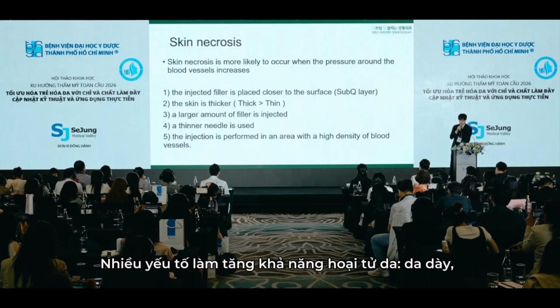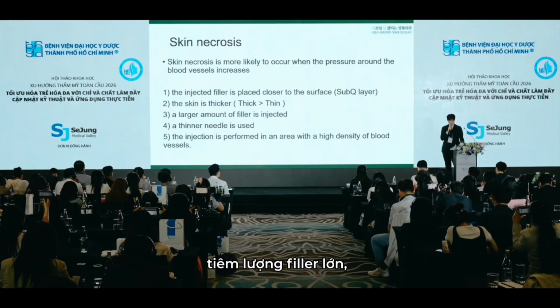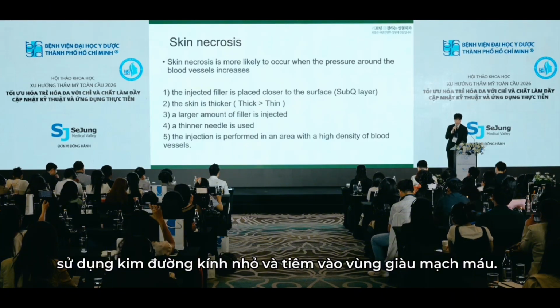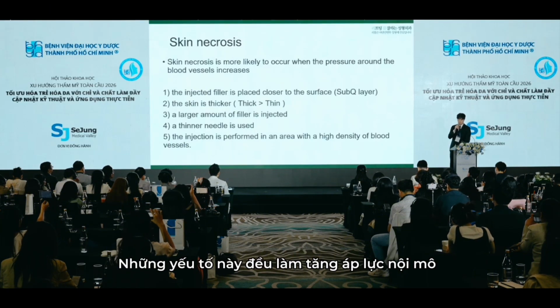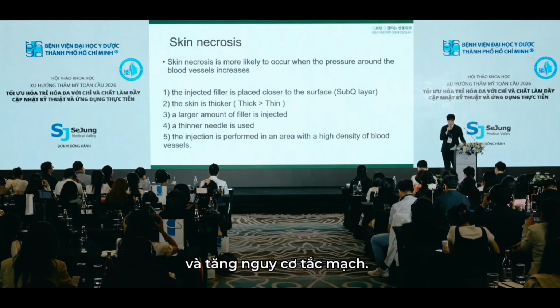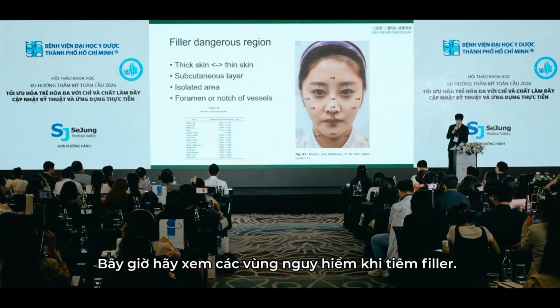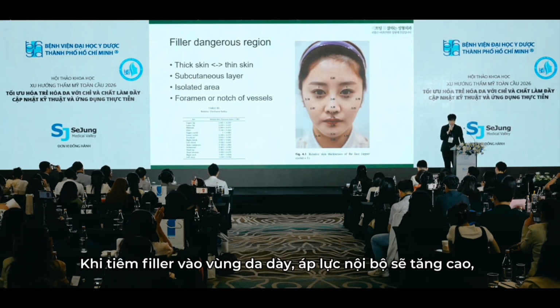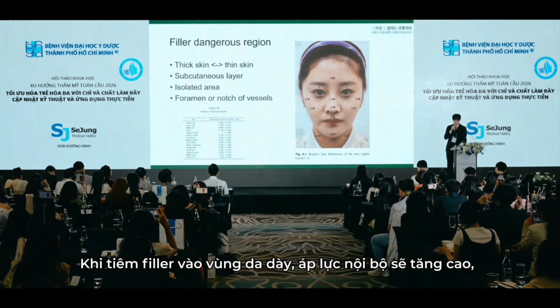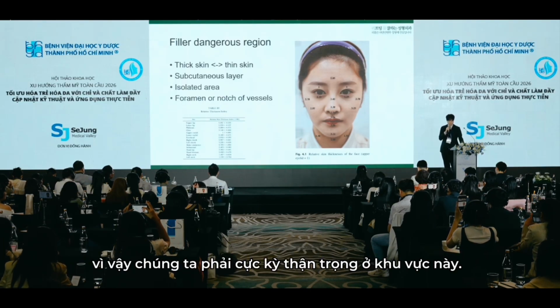Several factors increase the likelihood of skin necrosis: thicker skin, larger filler volume, use of smaller diameter needles, and injection in highly vascular area. These conditions all raise intradermal pressure and the chance of vascular compromise. Now, let's look at filler danger zones. When filler is injected into thick skin, internal pressure rises. So we must be extremely cautious in this region.